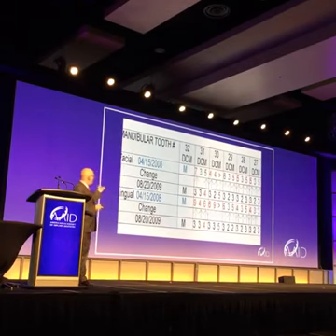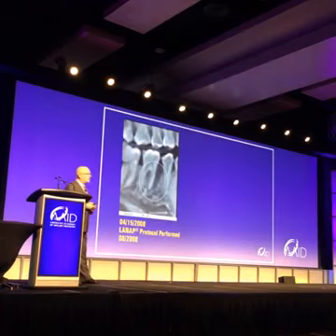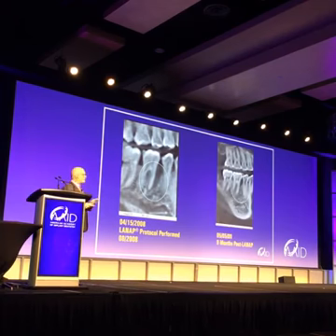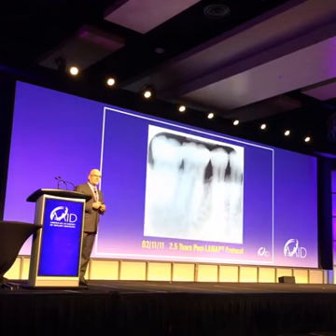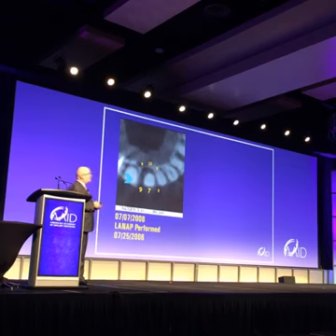Here's another one, tooth number 30. You can see it's great. We have a 10mm pocket on number 30, and now we brought it down to a 5 after treatment. I don't know what's wrong with it. I mean, my guess is it's an occlusion thing. 9 months later, that's what it looked like. That looks pretty good. Oh, I didn't put the 2.5 years in. Someone took out my slide. There's one for 2.5 years in there also.